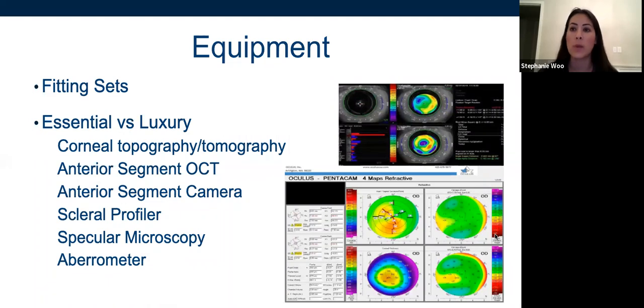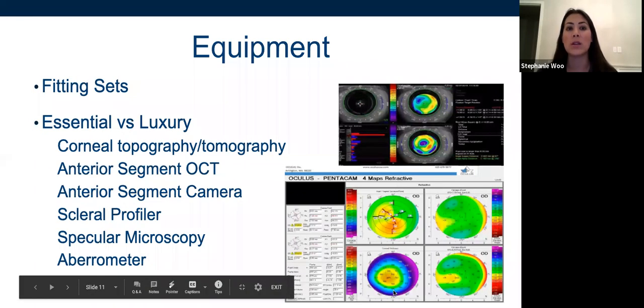So if I was going to spend the extra money, it ended up being for an anterior segment system where I can take photos, videos, fluorescein photos and videos, because that is, I think, super helpful for not only patient education, but also when you're communicating with the laboratory. So when you're saying, I'm seeing compression here and here, they may not know, well, how much? Is it a lot, a little? So it will really help them to help you. So I definitely think that's absolutely critical.